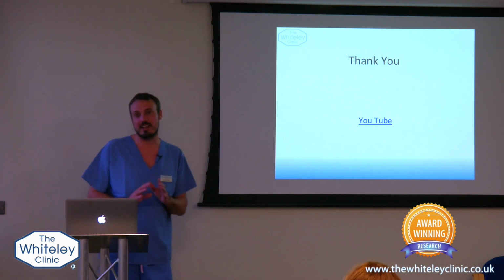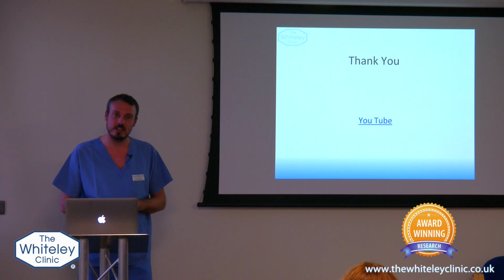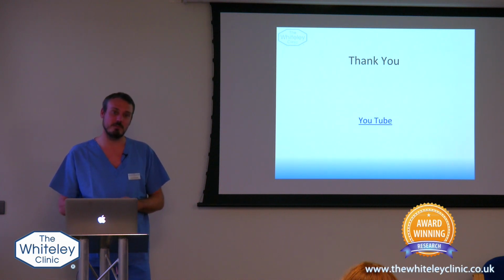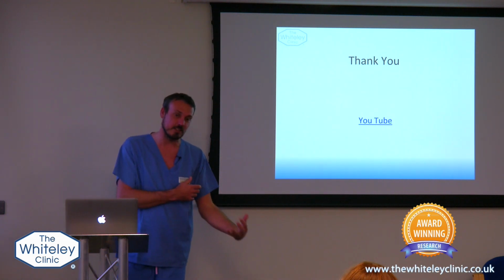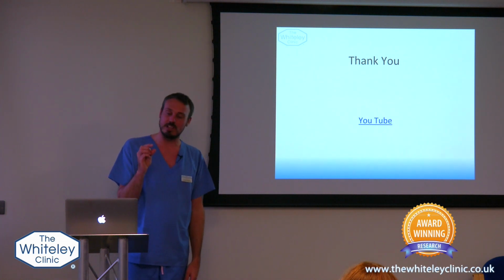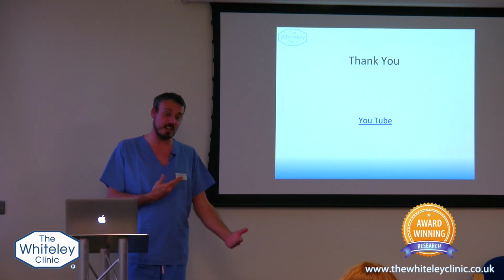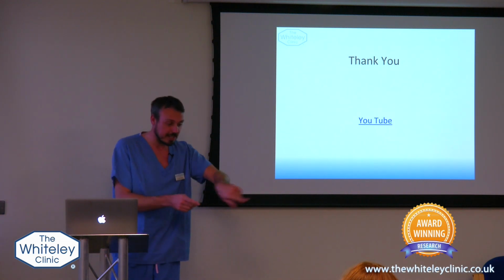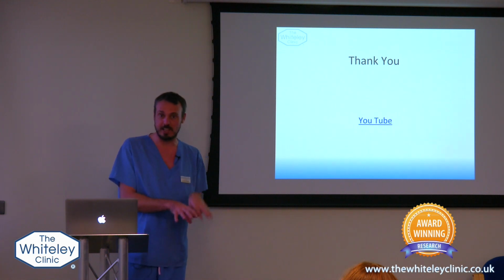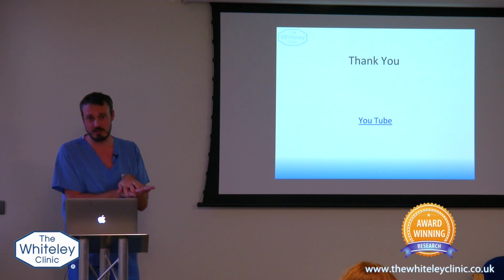So we tend to use standardized diameters now, around 10 to 12mm. So the coils are all 10 to 12mm, and we're putting them really deep into the veins and embedding them in there. Obviously, if you've got a short coil that's only, say, 2 centimetres long, that's more likely to move. If you put a coil that's 40 centimetres long, you're winding it into multiple territories of veins, and it's just going to stay there. And so I've never seen a coil migrate.